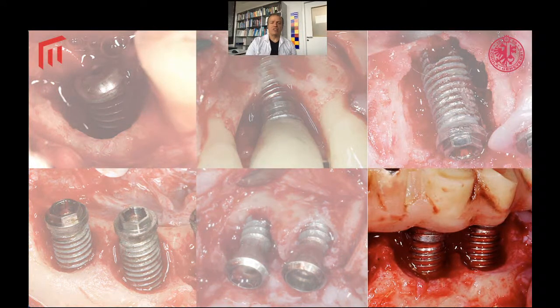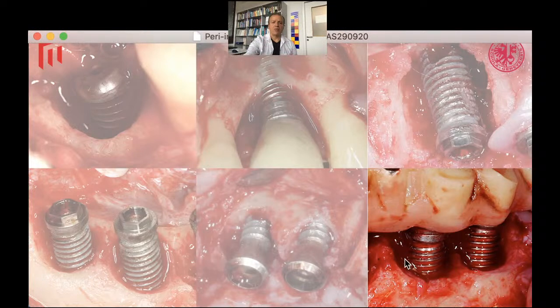So now in this case here, we have a primarily horizontal defect, and we have an old, low-tech implant surface. So we have a defect that has limited potential for regeneration, but allows us to have good access to the implant surface for decontamination. And we have an implant surface that is relatively easy to decontaminate, but also has limited potential for regeneration.